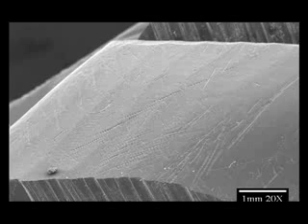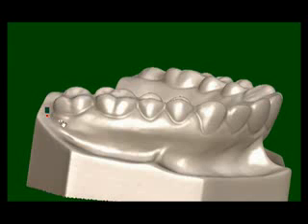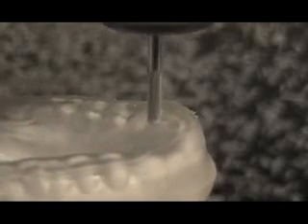Digitally produced splints have smooth functional surfaces, providing a skating rink effect that allows patients to freely contact the splint surface without being locked into place. Digital design ensures consistency, and high-speed machining provides an accurate and smooth splint surface. The process includes scanning, articulation, splint design, and milling.